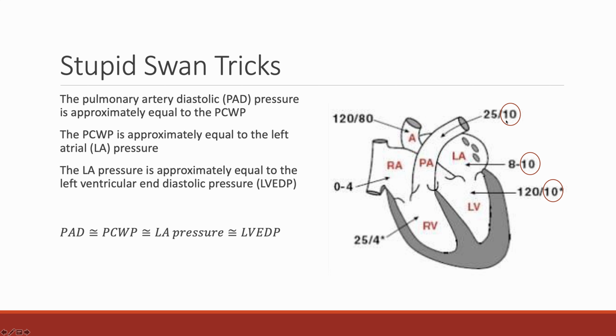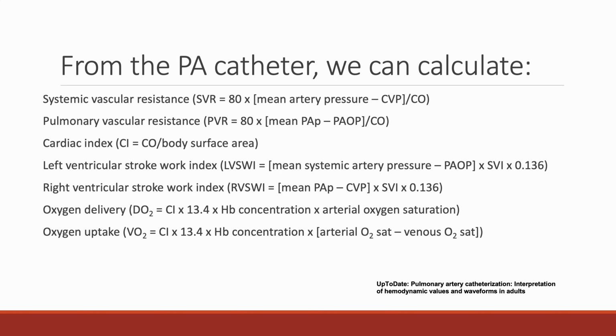there's no major reason that number should not be believable, such as severe mitral regurgitation, for instance, or mitral stenosis, then we can believe that the pulmonary artery diastolic pressure is 10. All right, as long as there's nothing wrong with the mitral valve. Cool, right? I love that so much.